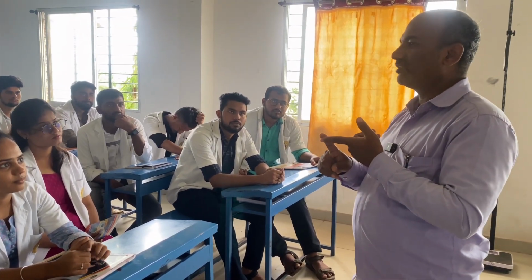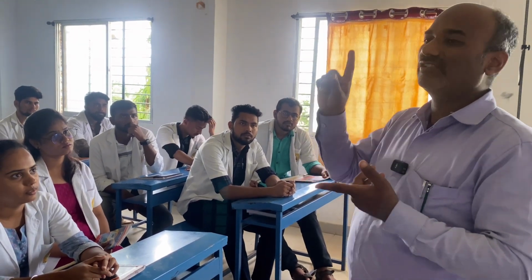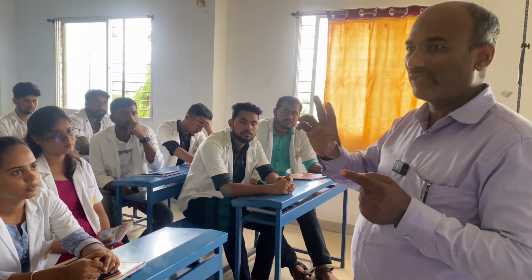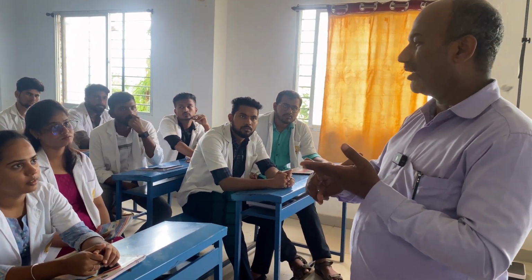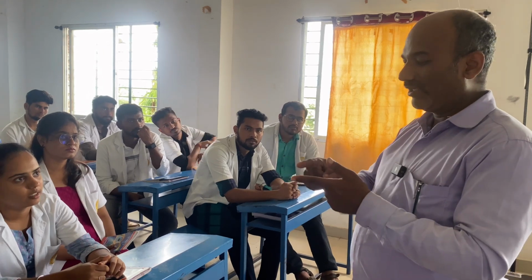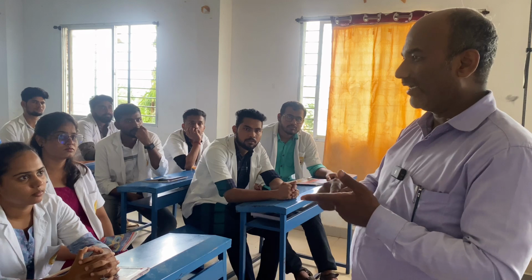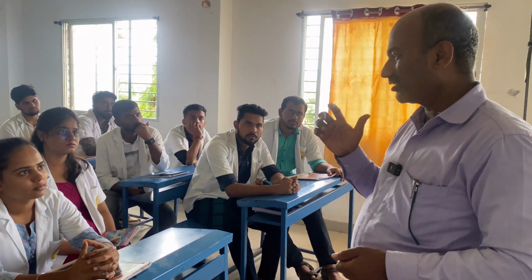The first refractive media begins with the tear film, cornea. Both the surfaces of the cornea act differently, right? So tear film, cornea, aqueous humor, both the capsule of the lens and the lens, collectively called the lens, vitreous humor. So any media opacities in the tear film, cornea, aqueous humor, lens and the vitreous can be seen with direct distance ophthalmoscopy.